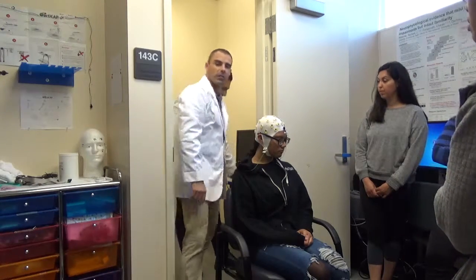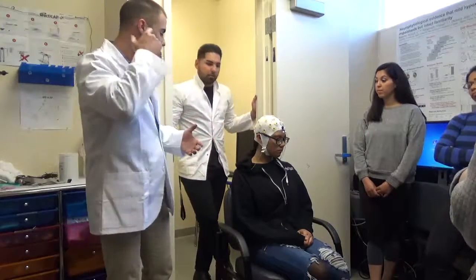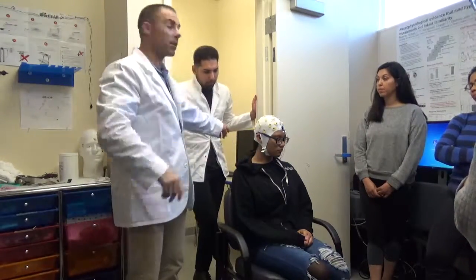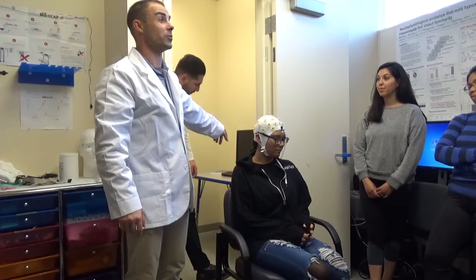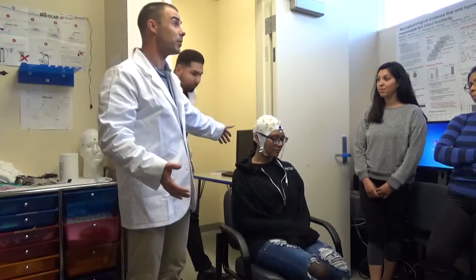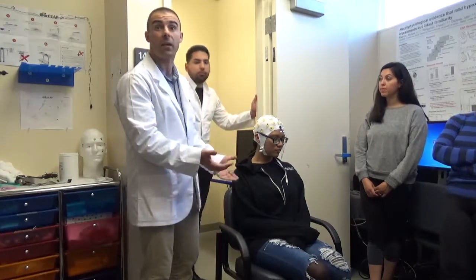Now here's the thing. A couple of things to note that are really important, or very practical about this point. So now, she is connected, which is why it's tough to go to the bathroom. I mean, she can go to the bathroom, it's just going to be a tough mess to clean up, right? But she's connected, and so you want to be mindful of that, because they tend to not do anything, which is perfect, right? They just hang out.